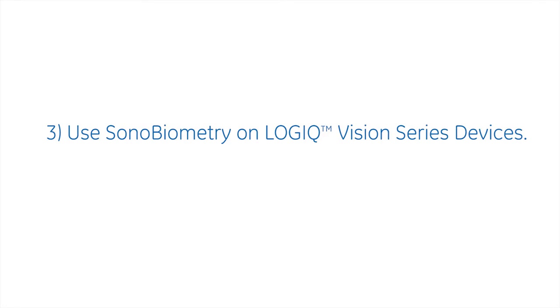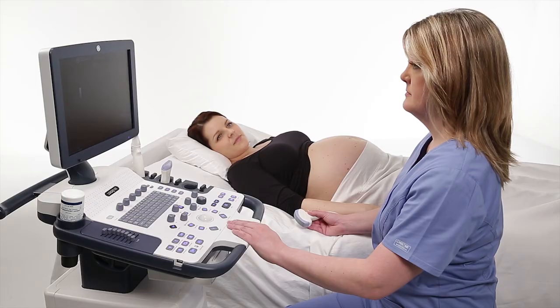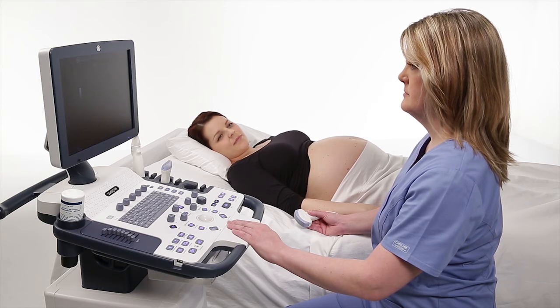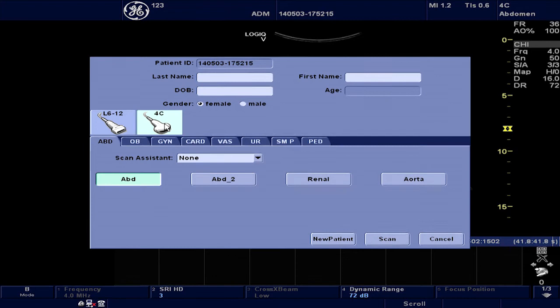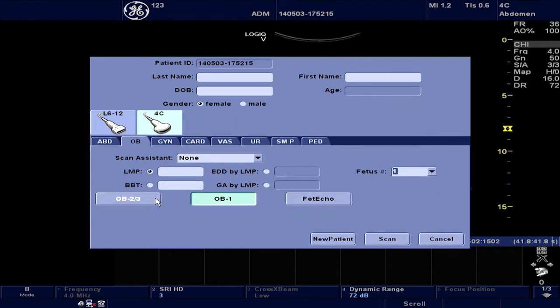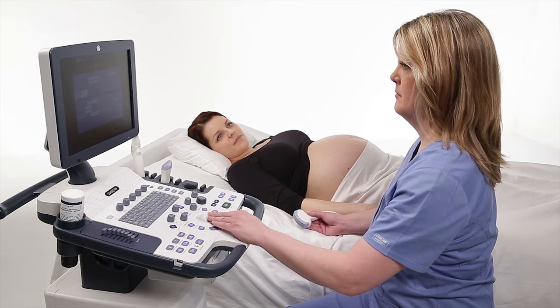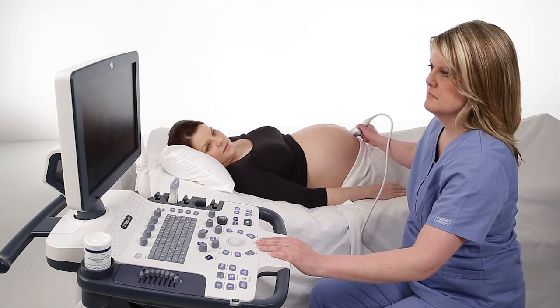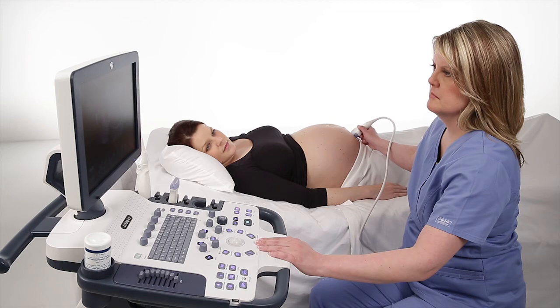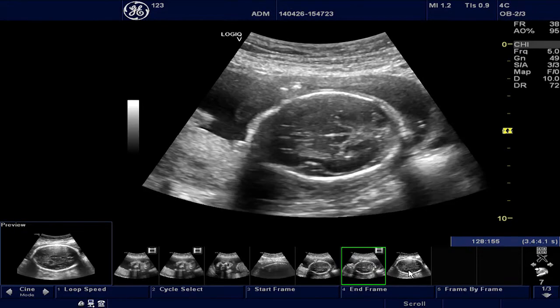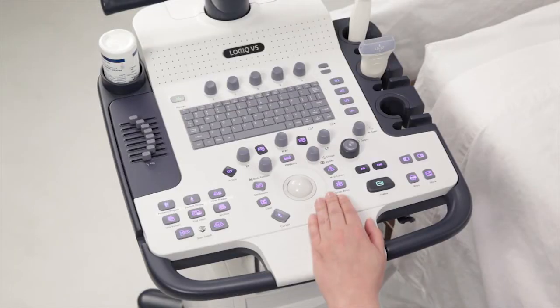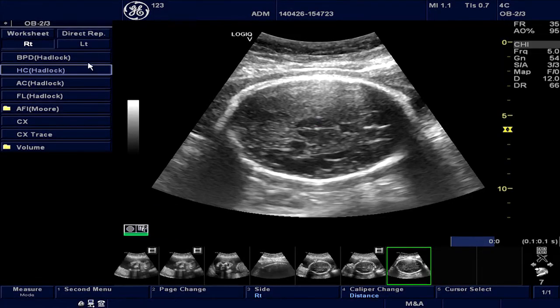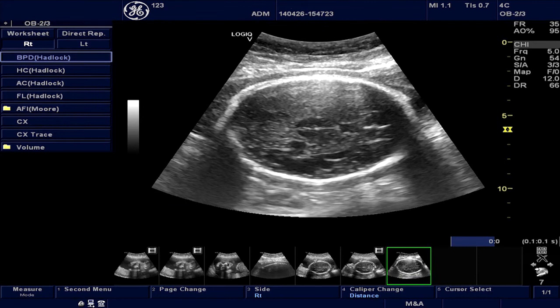How to use Sonobiometry on Logic Vision Series devices. Let us now go over the Sonobiometry feature on the Logic Vision Series systems, understanding the basic controls and workflow. On the patient screen, select the Obstetrics application and load the OB-2-3 presets for the related measurements to be displayed on the measurement menu. You can use Sonobiometry on both frozen as well as recalled DICOM images. In this example, we will use a fetal head image to show how the tool works for BPD measurement. Once the image is frozen on the screen, press the Measure key to activate the measurement menu and select the BPD measurement. The system automatically places the calipers and generates a measurement of the BPD.